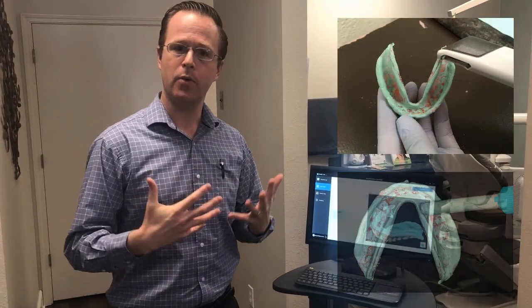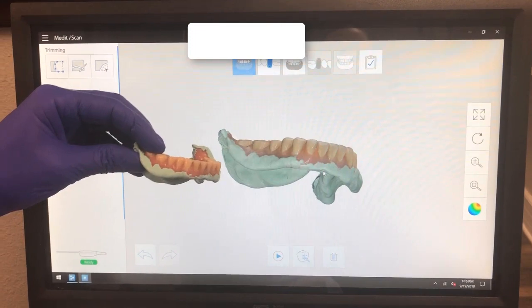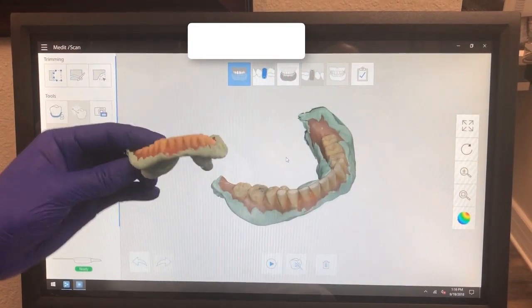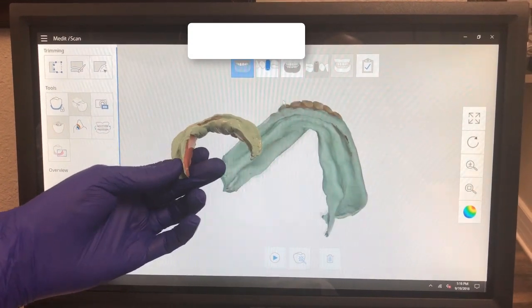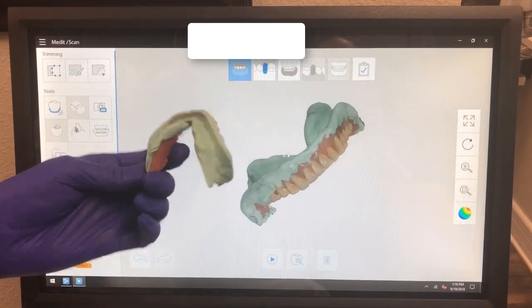It essentially involves taking a radio opaque PVS impression material, relining the denture, and then going ahead and taking an intraoral scan or a cone beam scan of it. Historically, it's always been in the realm of 3Shape Trios to scan 360 degrees, because it's really hard to scan 360 degrees with an intraoral scanner. With a radio opaque PVS denture, I'm essentially taking the patient's denture, relining it, and then scanning completely 360 degrees around.